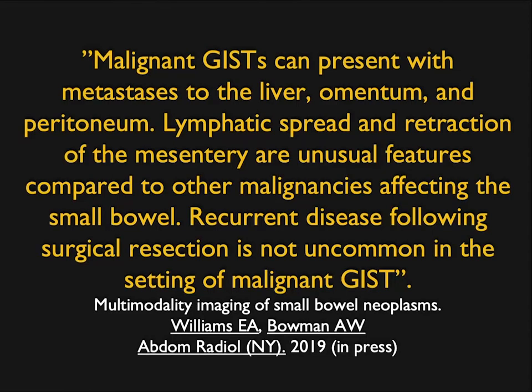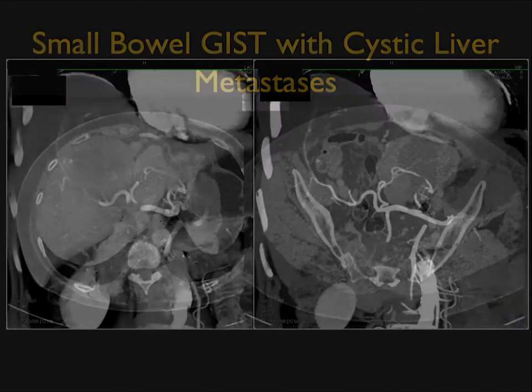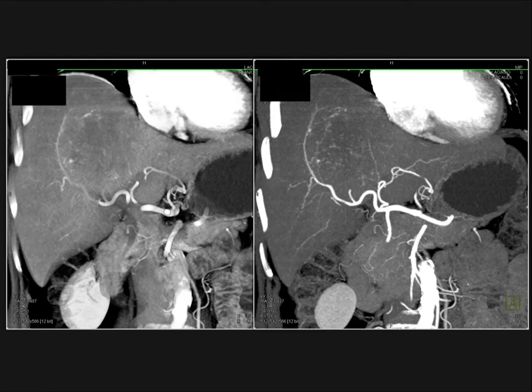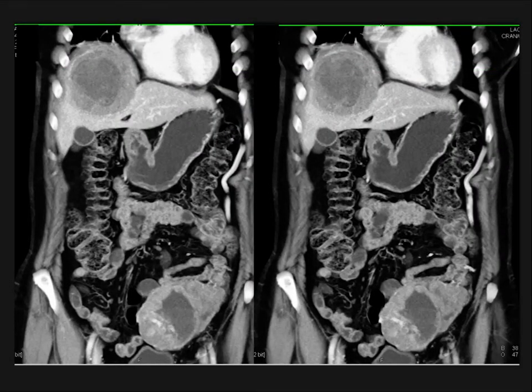A recent article by Williams and Bowman notes that malignant GIST tumors can present with metastasis to liver, omentum, and peritoneum. Lymphatic spread and mesenteric retraction are unusual features compared to other malignancies. Recurrent disease following resection is not uncommon in malignant GISTs, especially aggressive ones. Here's a good example: large mass in the left lower quadrant — could be adenocarcinoma or lymphoma, no bowel obstruction, large and ulcerating, not very vascular. But look at the liver mass — large cystic necrotic tumor, with neovascularity on MIP imaging. When we talk about cystic or necrotic liver mets, we think of ovarian cancer, GIST tumors, and melanoma. These coronal views nicely show how large the tumor is and the liver mets.